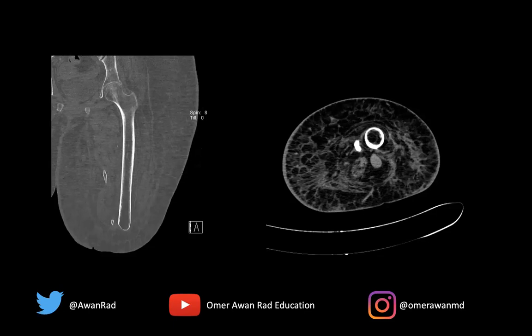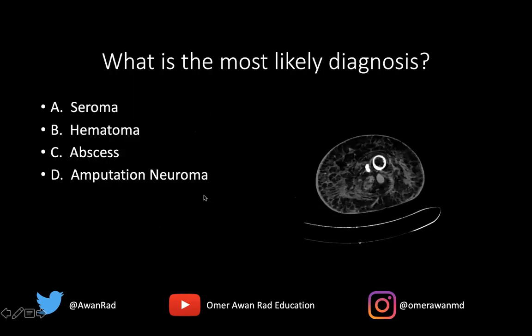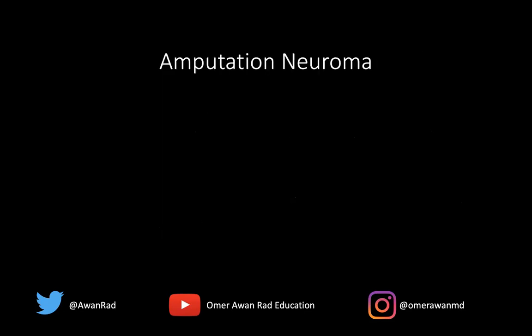We also have diffuse atrophy of the musculature here, some skin thickening and subcutaneous edema. But really the important thing is that we have this fusiform thickening in the region of where we expect the sciatic nerve to be in a patient that's had an amputation. So the most likely diagnosis here would be an amputation neuroma, based on the history that you should have inferred and deciphered.